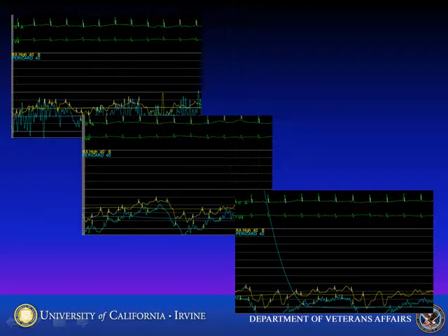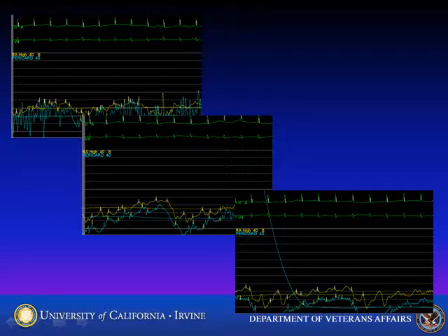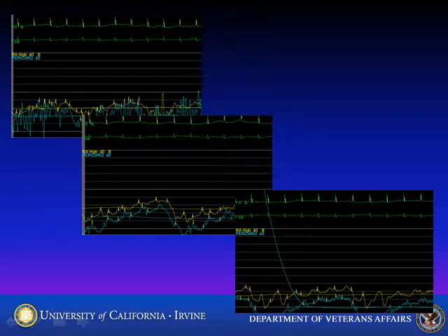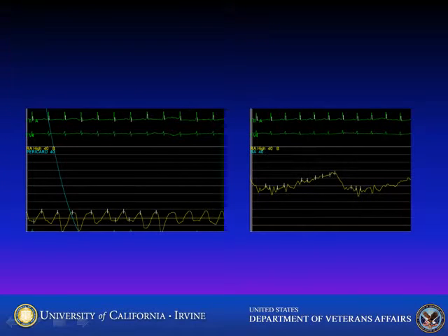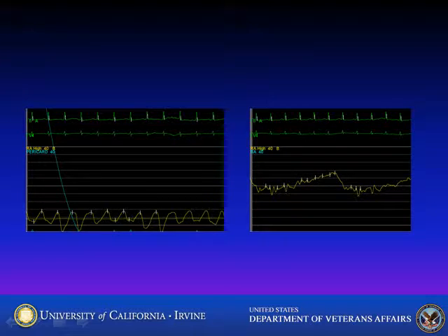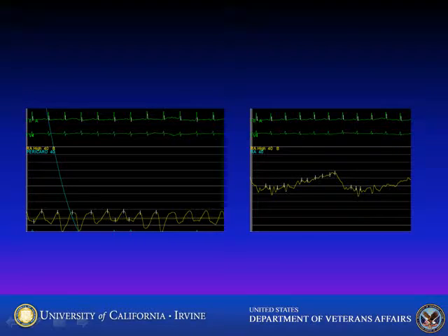These three tracings show a progressive decrease of right atrial pressure — in yellow — and corresponding pericardial pressure — in blue. With removal of 300, 600, and 900 milliliters of fluid, the RA pressure has fallen from 20 down to about 8, and pericardial pressure has fallen to about 2 on the far right lowest panel. The final right atrial pressure averages about 3, with restoration of the A and V waves. The pericardial pressure is now barely visible, rising from its negative position. On the right side was the starting right atrial pressure, illustrating the marked difference in response after draining the pericardium completely.